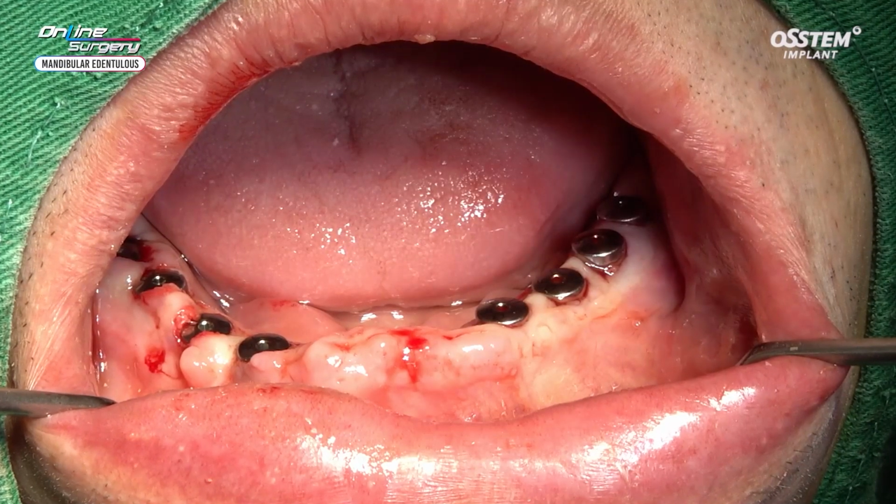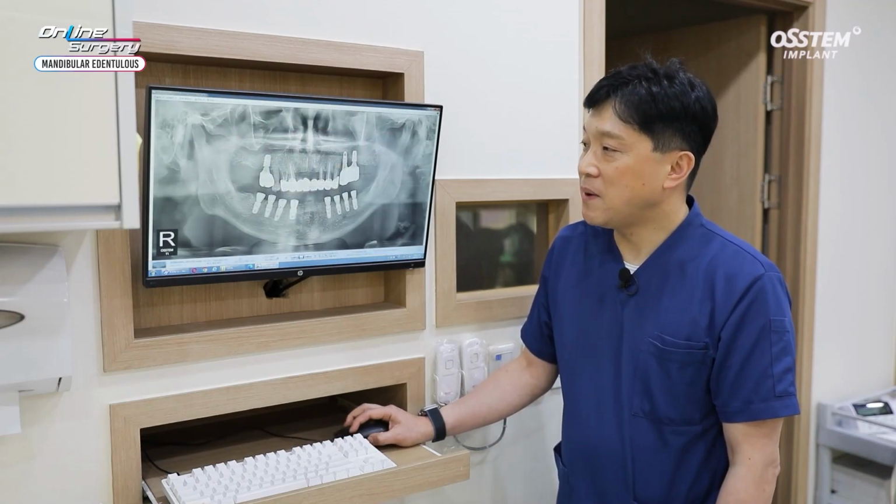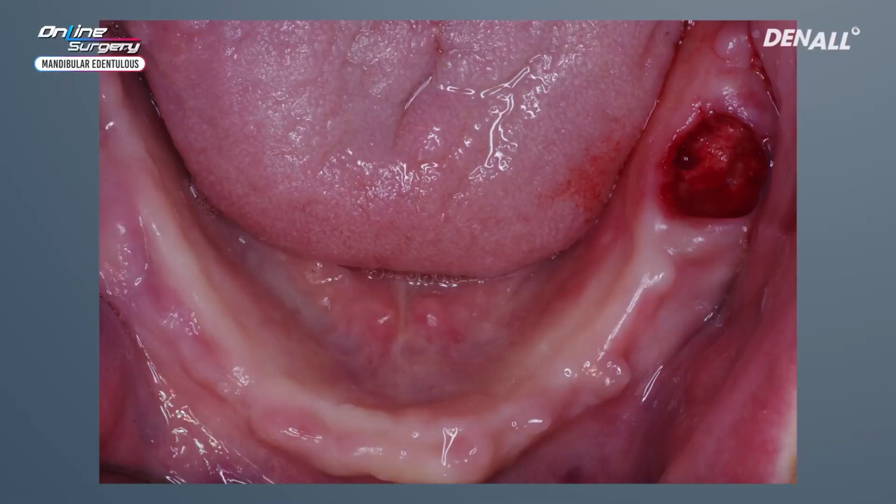Surgery is complete. Let's look at the surgical results. If you look at the panoramic image, OneGuide was used to place the implants. So they have been placed very nicely. This is a ridge after extraction.